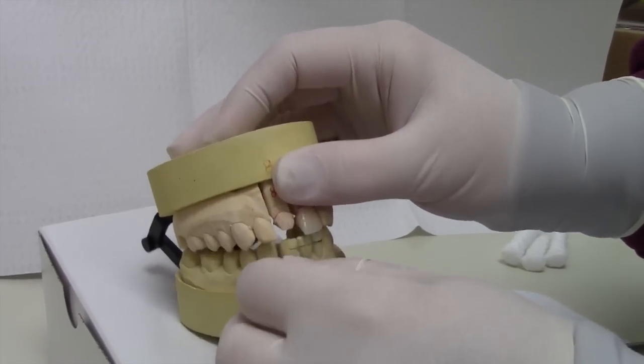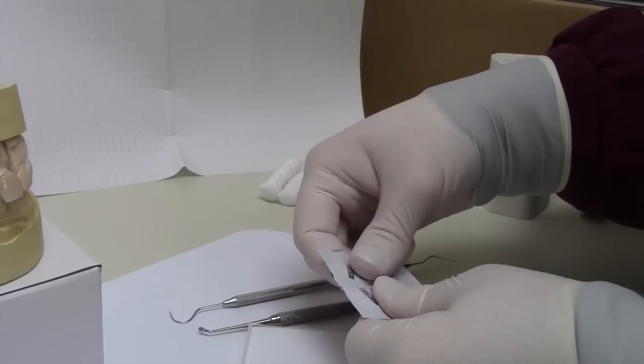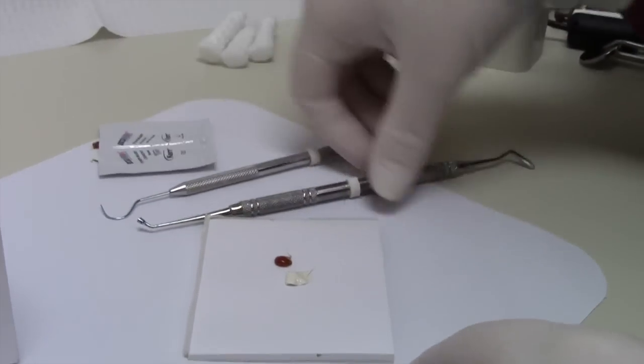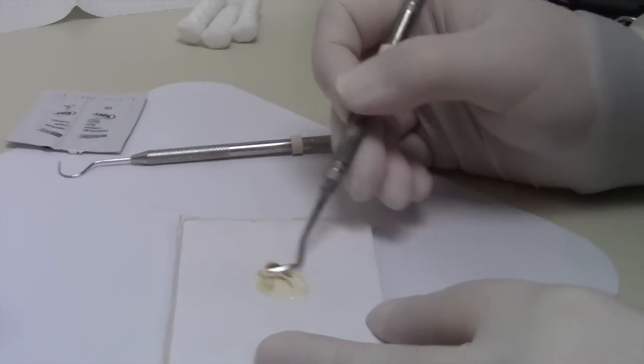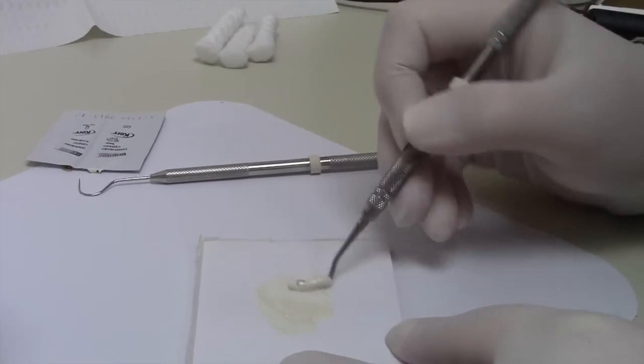Now we are ready to cement. When mixing the temporary cement, use a disposable plate to express equal parts of temp bond. Mix cement with a toothpick or a disposable butter knife until cement is all one color.